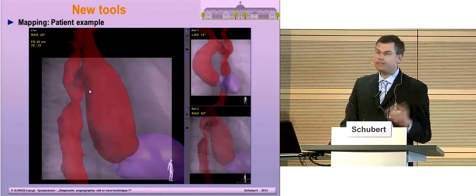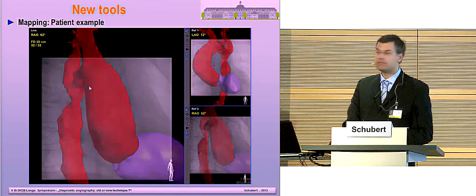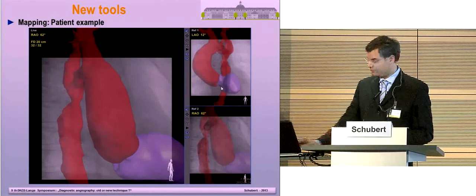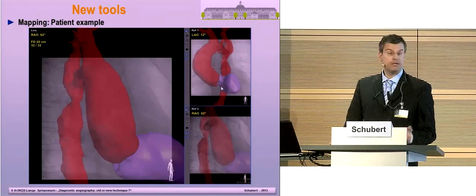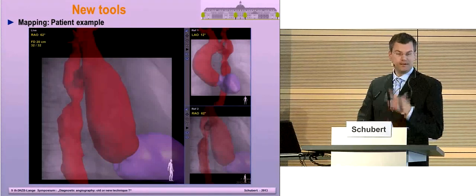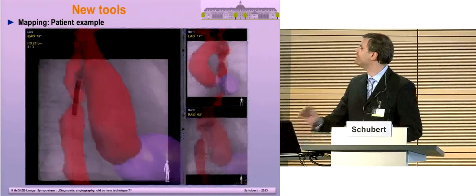I maybe don't need angio. I wouldn't rely on it at the moment, but it's still in progress. But I think I can do the pullback and the measurements just from the MRI data, and confirm it maybe with the fluoroscopy data. In addition, in comparison to the morning session, now we have colorful pictures in the cath lab. I think this is quite important.